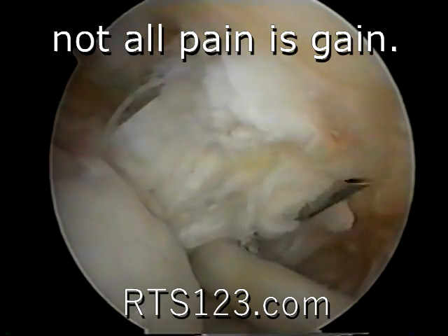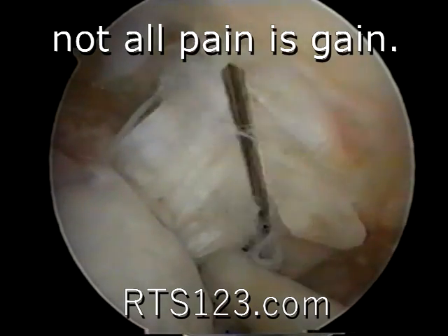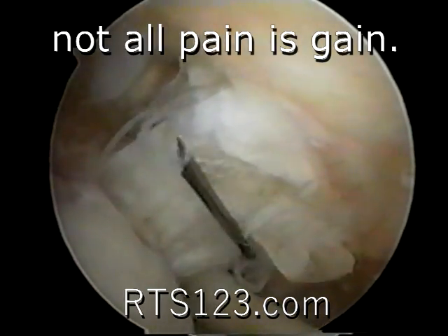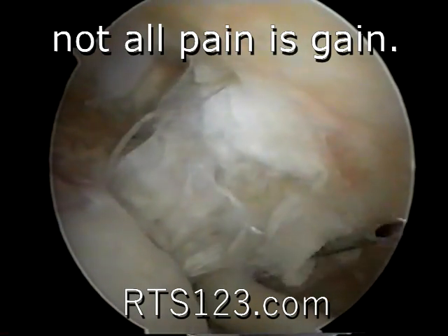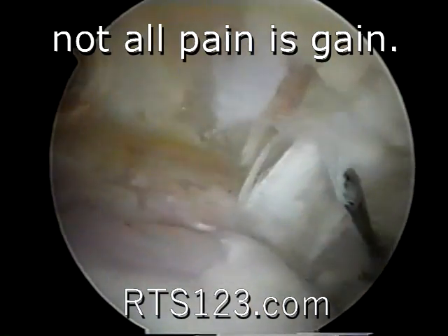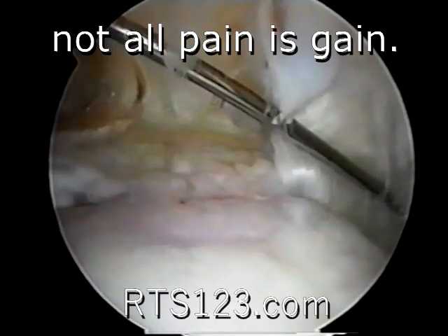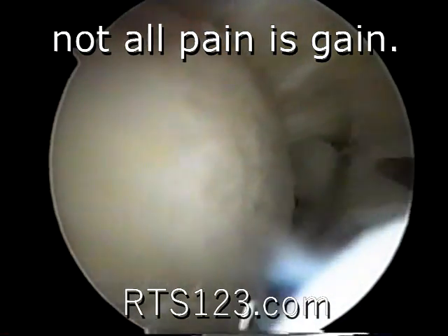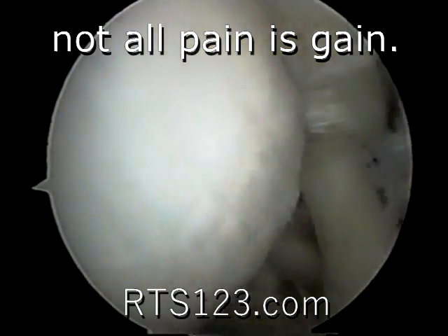This is a shoulder that should not be weightlifting. I'll be very serious with you about that. You can do some leg work and some arm work, but this is not a shoulder that can do bench presses and militaries and lat pull-downs and things like that, because we'll never be able to get it back absolutely perfect the way you want it. So this is the reason why we videotape these things, so we can show you what your limitations are going to be. I'm going to go ahead and put a shaver in here and start tidying things up.